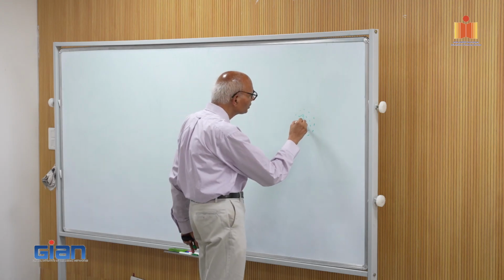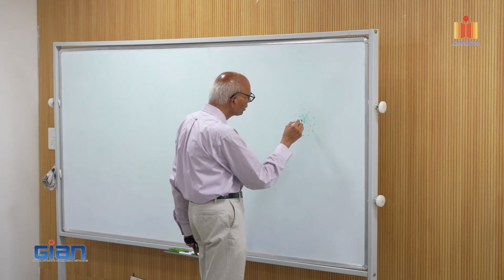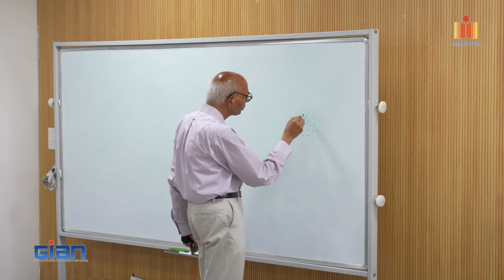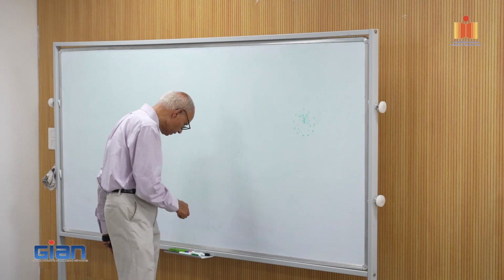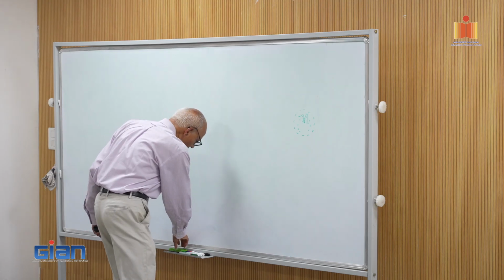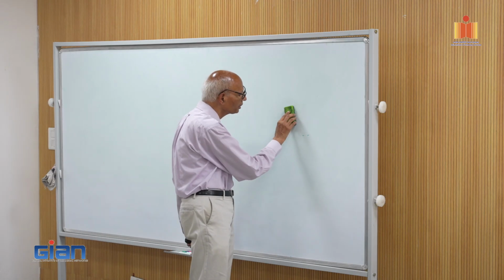Something like this will contribute some kind of a dose here. So you have to take the dose from each of the spots at this point and then sum it. Only then can you get the dose given by all those spots all around, giving you the dose to this point. That's how it has to be done.